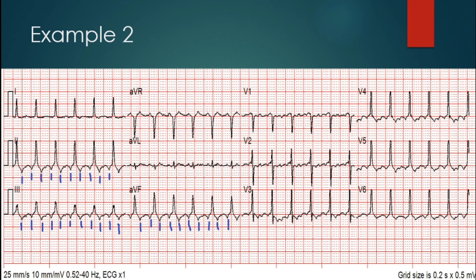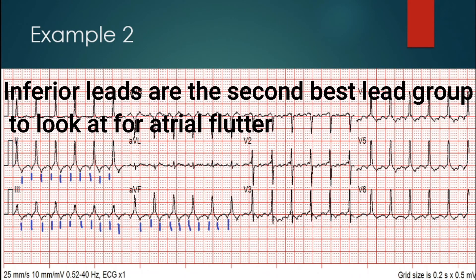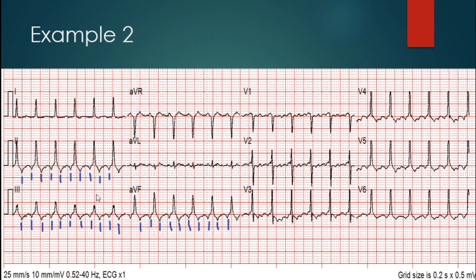Now let's check out the second example. Let's check out V1's atrial activity — you can see a little bit there. Like I said before, look everywhere for atrial activity. In this example you can see parts of the flutter waves inside the inferior leads, highlighted in blue, and you can see they're marching out at a consistent rate of around 300 beats per minute.